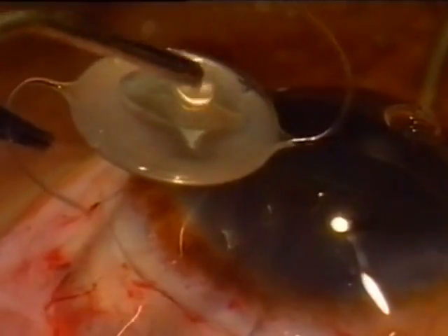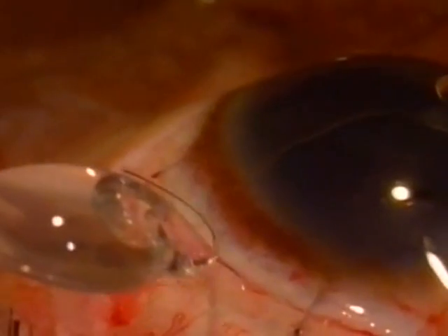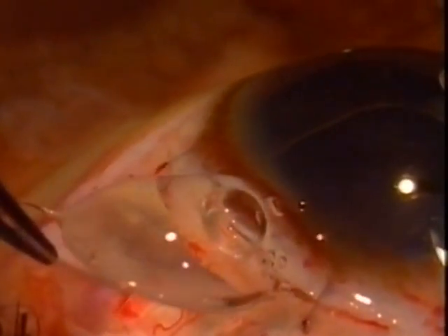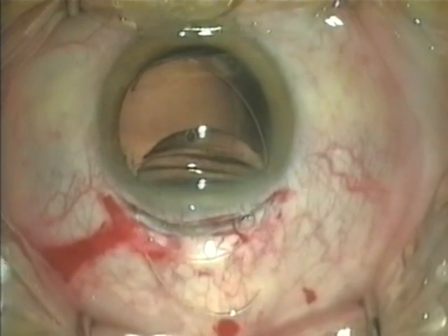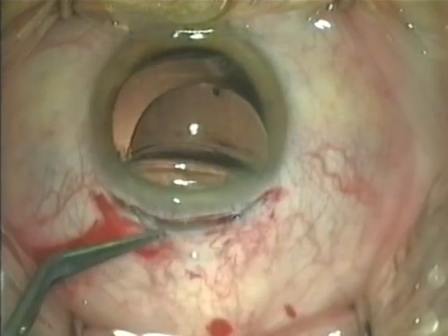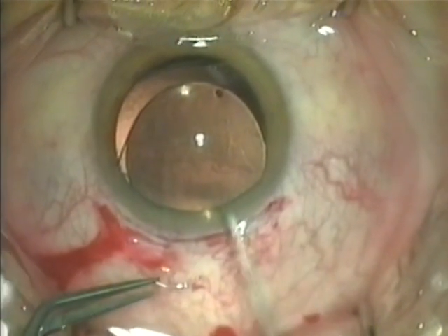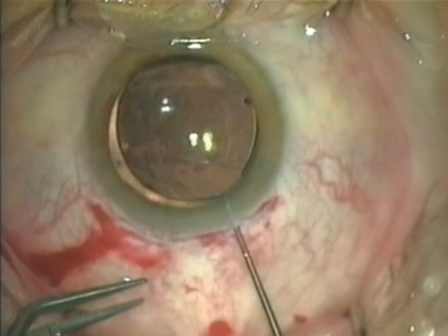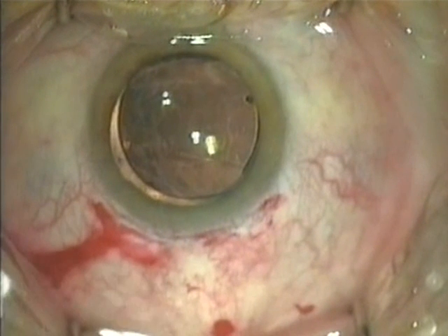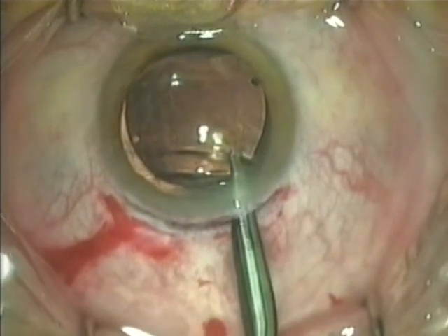The lens implant is inserted under the flap of the anterior capsule so that it lies in the capsular bag. The leading haptic, with the tip pointing to the left, is introduced through the linear capsulotomy followed by the optic. The lens is dialed clockwise whilst pressing it backwards and compressing the lower haptic. As the lens rotates clockwise the lower haptic slides up under the upper leaf of the anterior capsule. Once the intraocular lens is secure inside the eye, the anterior capsule is cut with a pair of micro scissors.